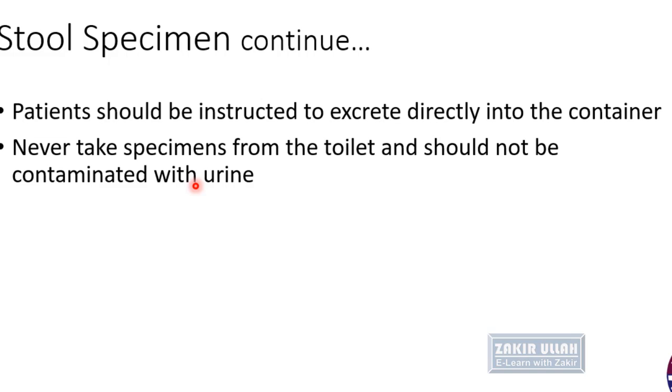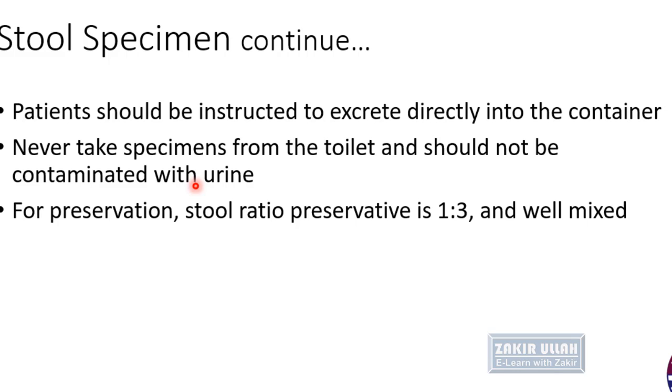It is difficult to understand which bacteria are part of the disease process, which are part of the normal flora, and which have been taken from that toilet. So never take a specimen from the toilet. Also, contamination with urine disturbs our results, so urine contamination should also be avoided.